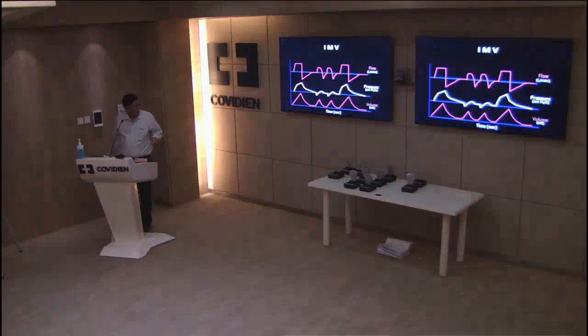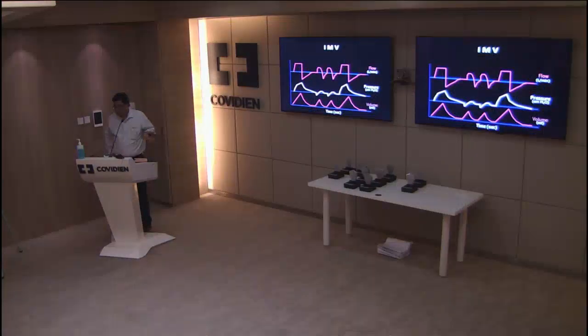Then, of course, another mode that was very popular in the past, fortunately or unfortunately now getting completely out of vogue, intermittent mandatory ventilation. The premise was that the patient is breathing spontaneously, but in between, the ventilator delivers some breaths to so-called support the patient. But actually, suppose the patient is breathing 30 times a minute, it doesn't mean that the brain stops triggering the moment he gets a mandatory breath. The brain can't suddenly stop. So the brain will continue to trigger 30 times a minute. So the mandatory breaths don't really help in giving the brain rest or giving the diaphragm rest.